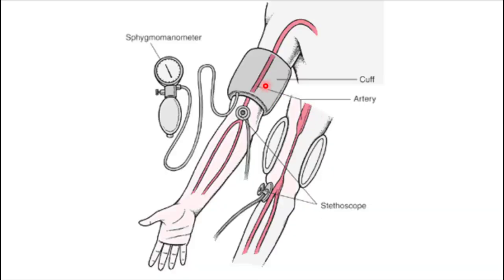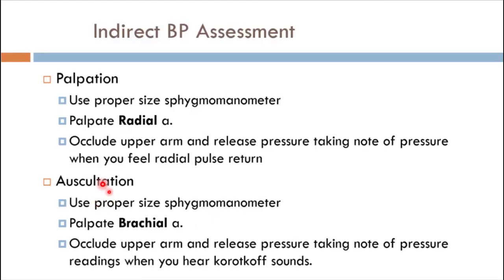Basically what you're doing is the blood pressure cuff acts as a tourniquet. You are, in essence, squeezing that as it inflates, and you are stopping blood flow, like it's cut off. And if you kept the blood pressure cuff on long enough, you would start to get uncomfortable. You get some tingliness down the hand, and you start to get some color changes. That's why we try to do blood pressure within 60 to 90 seconds, and we try not to do repetitive measures on the same arm. This auscultation one is the one that we're going to be doing. It's one that we use all the time, and it's used in most medical facilities.